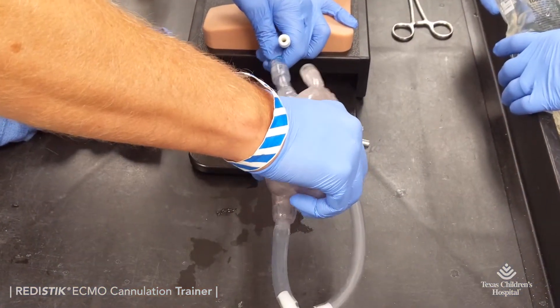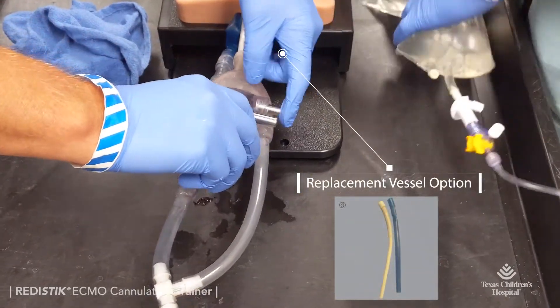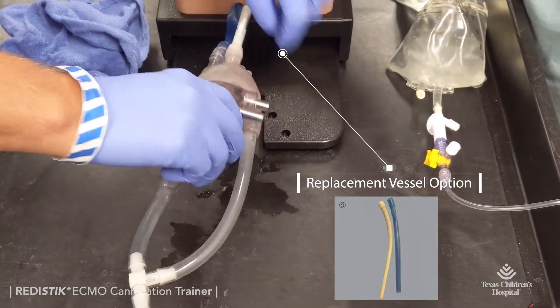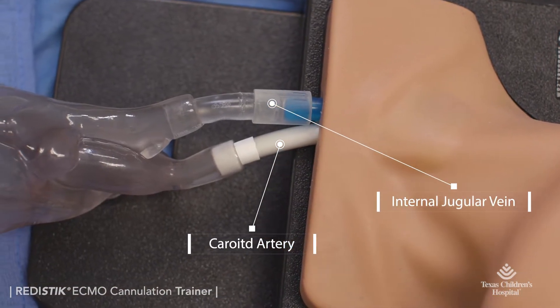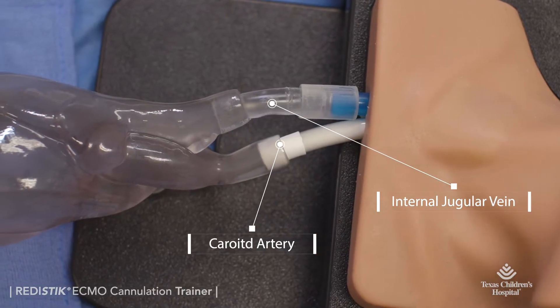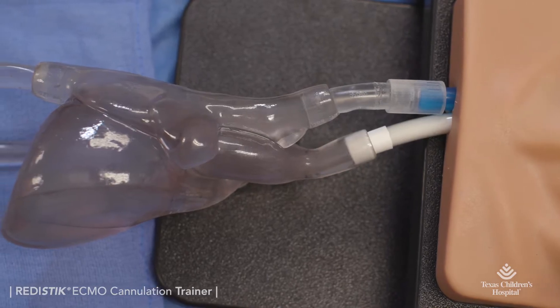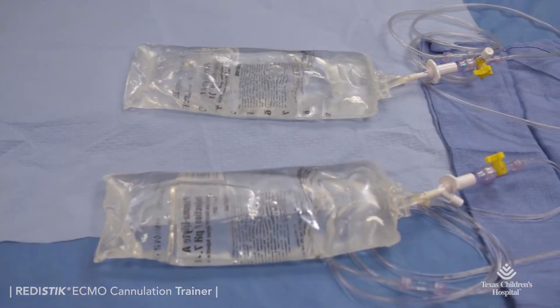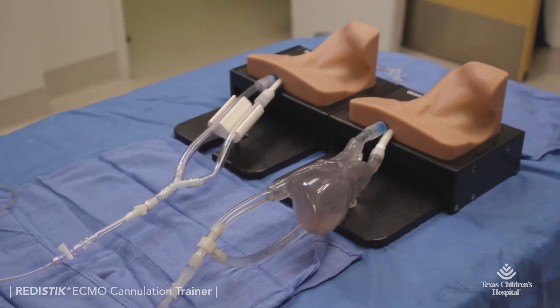The previously cannulated neck simulator can be reused by replacing with a new set of vessels and connecting to the closed-loop system of your choice. Below the neck is a reusable, transparent closed-loop system, allowing visualization during cannula insertion and while connecting to the ECMO circuit.